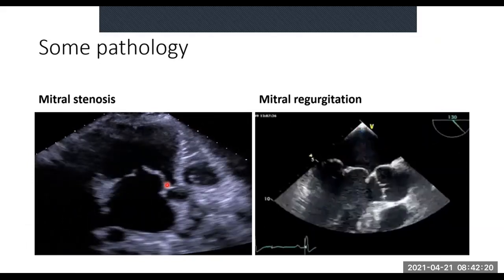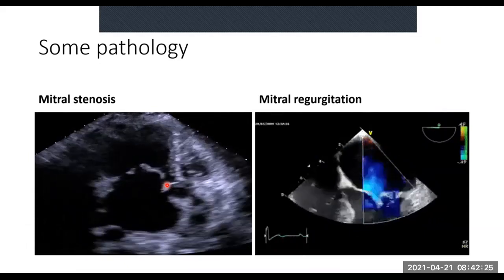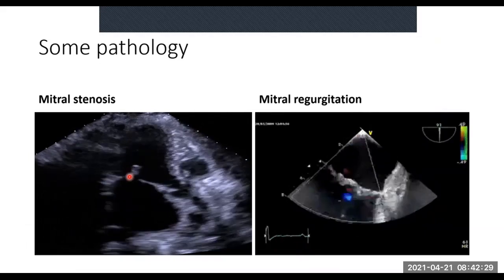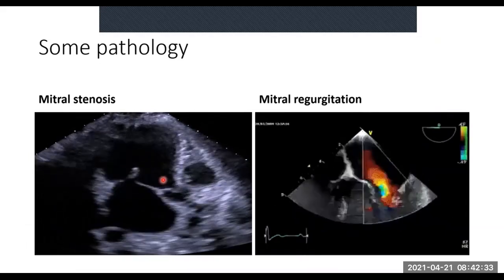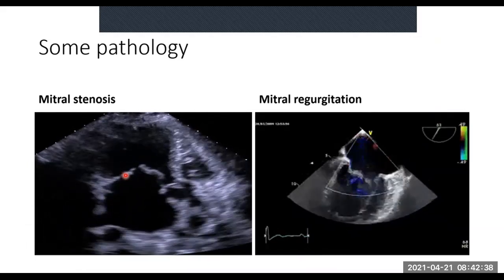All right. So what does mitral stenosis mean? A mitral valve that is unable to move or to open up properly, which we can actually see over here. You can see there is movement and there's actually bowing of the mitral leaflet and things like that, but this is the stenosis side. It's not really moving, all right?